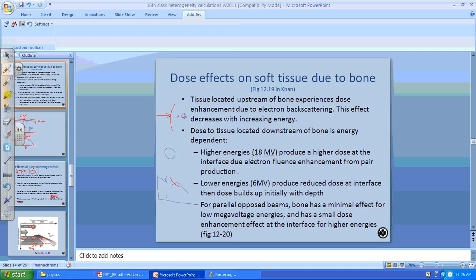And then, if it's Eclipse, you're going to give it a Hounsfield unit. Okay, so you're going to say it's a Hounsfield unit of whatever you think it is. And so you assign that, and then you assign the rest of the body as water. Okay? And you can do that. You can go in Eclipse, click on the body, right-click, assign CT density, and you assign the body as water. Okay? And then it doesn't use the CT pixels. It doesn't use the grayscales. Okay? So it uses whatever you've assigned to it.